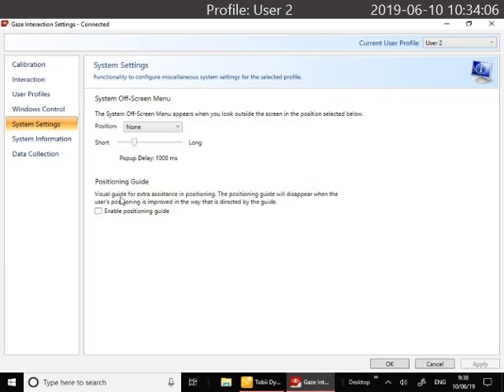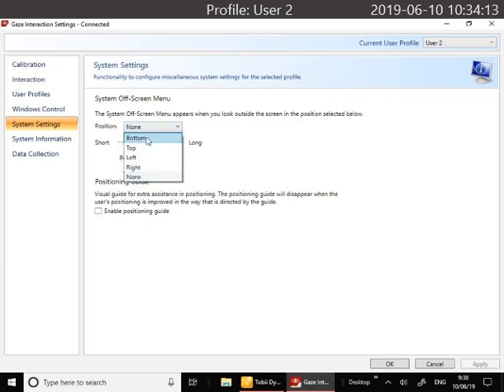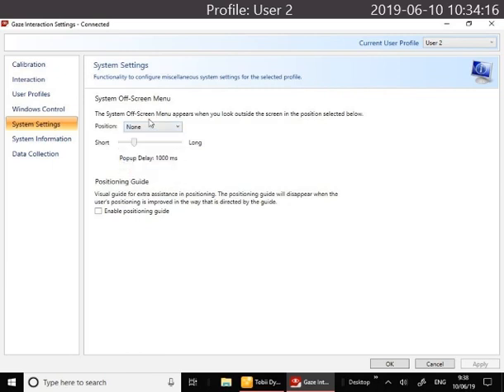In System Settings you can set an off-screen menu, so when you look at a particular position, maybe it's the bottom, top, left, right, then you'll bring up a pause for the eye tracker. This can be really handy for some users, but for others you might find that they don't need it, so you can set that position to none.